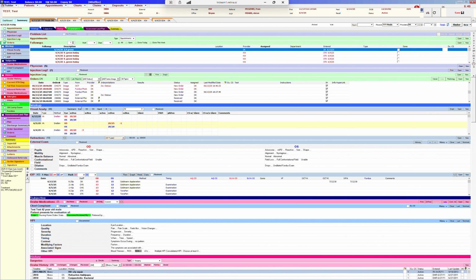You'll now go on and obtain the patient's visual acuity. We do things in a little bit of a funny order. We get the acuity and some of this testing first, and the whole point of this is so that we can get dilating drops in the patient as soon as possible. You do not want to hold that to the end. We want to do it up front.